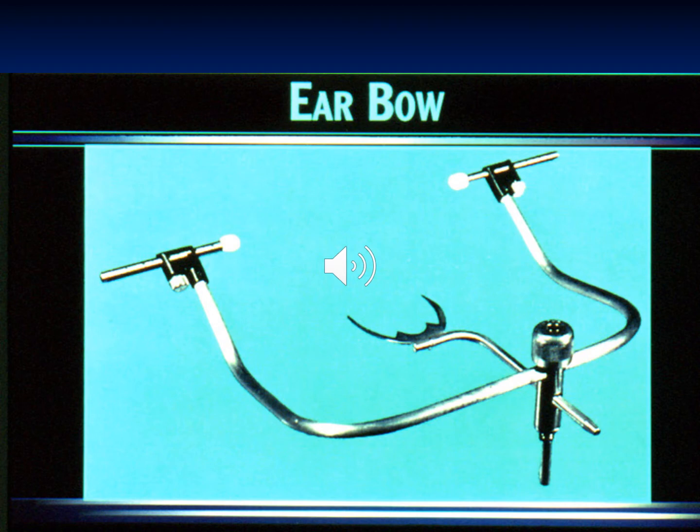Here is a closer look at the face bow. Of course, this face bow is called an arbitrary face bow, in contrast to the kinematic face bow. The kinematic face bow is a more sophisticated instrument that is fixed to the maxilla and the mandible, and we use it to try to find the axis of rotation more accurately. However, it's much more sophisticated than this tool, and therefore we are not going to discuss it. And we'll focus on the arbitrary face bow in this discussion.